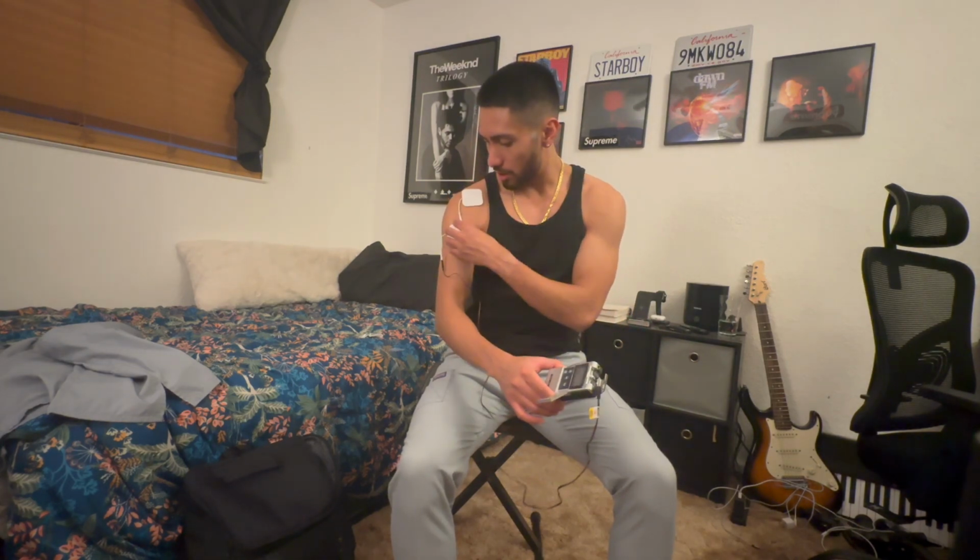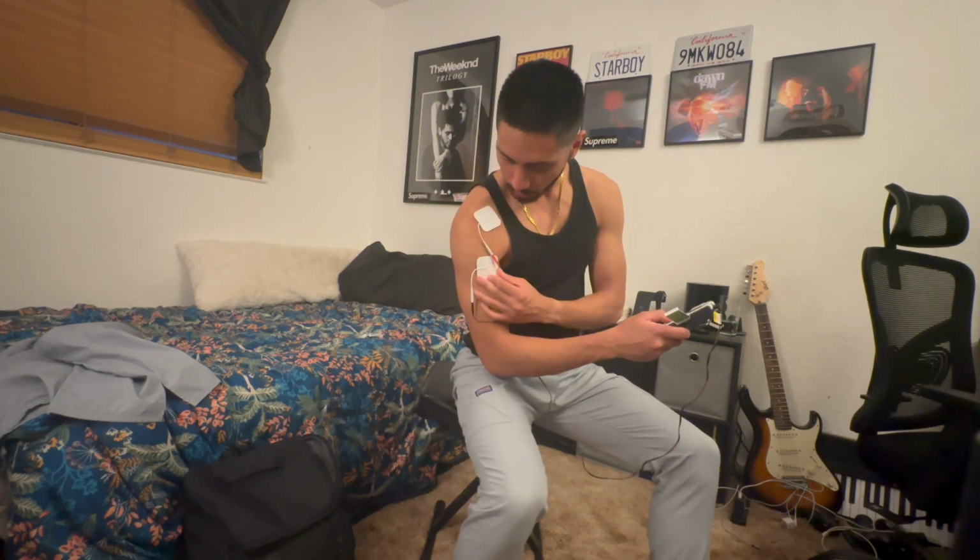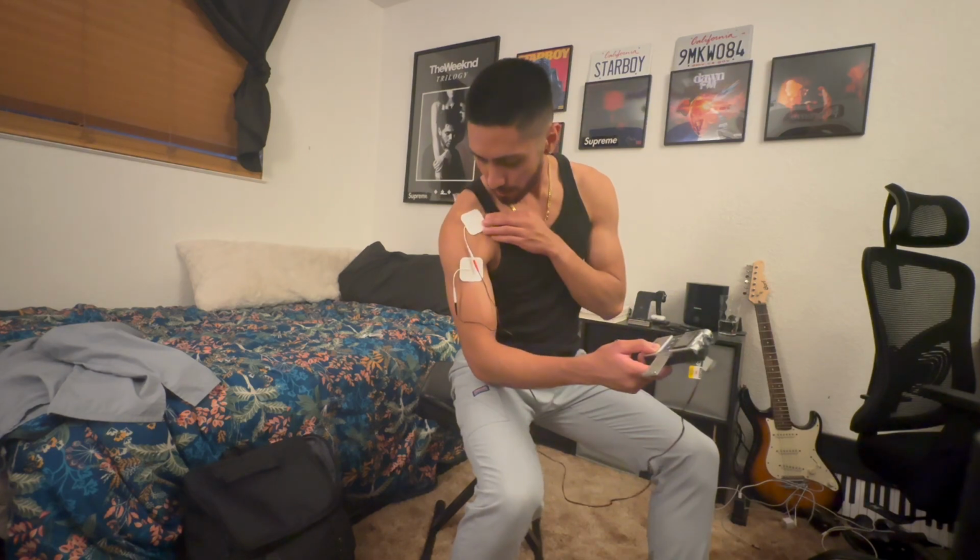And right away, I feel a bigger difference rather than taps going on with muscle fibers. It's almost like something is crawling on my skin, or it's like driving in a car on a bumpy road and it's very constantly vibrating. That's what I'm feeling going on in this shoulder with these tingling sensations. I can adjust that so it can be stronger with the width. We're not seeing too much muscle fiber contraction where it's like the tapping. Very, very small ones going on in here. And then my intensity, I can just adjust that the way I like it.